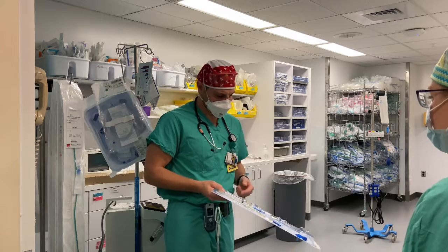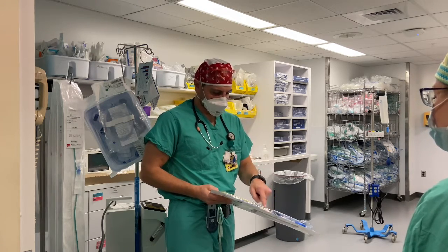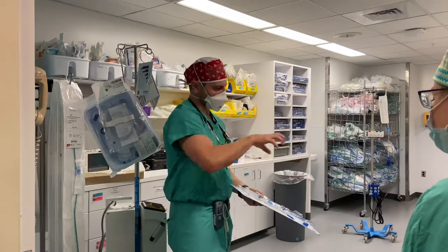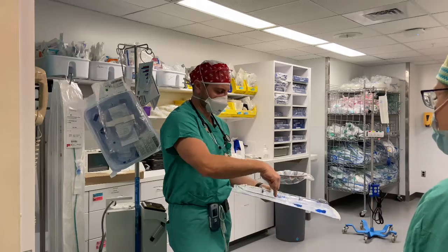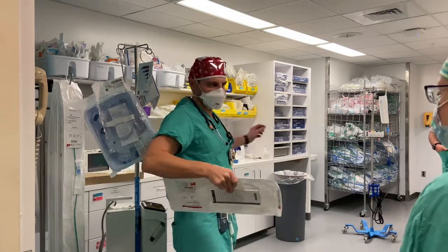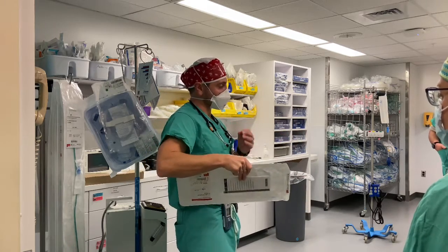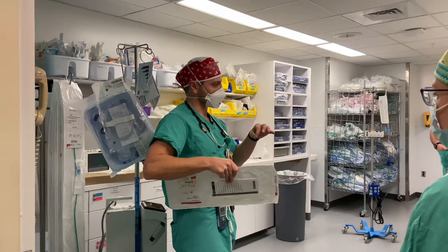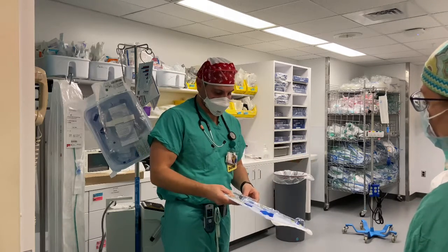There are other little connectors in here, so if you wanted to put suction on this blocker to deflate the lung on the side that it's pointing at, you have to actually take the wire stylet that's on the inside of this out. So this little white piece, pull the white piece off, the wire that's going through the center of this comes out, and then you have a channel in it that you can put suction on, or you could blow oxygen into, okay? So these connectors are designed to help you with that.